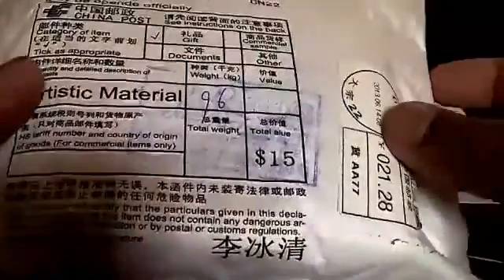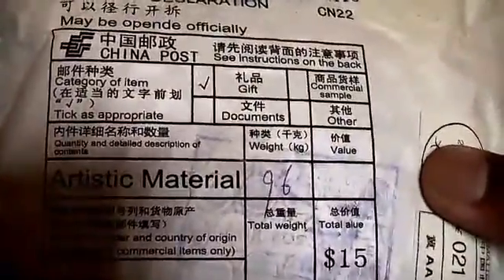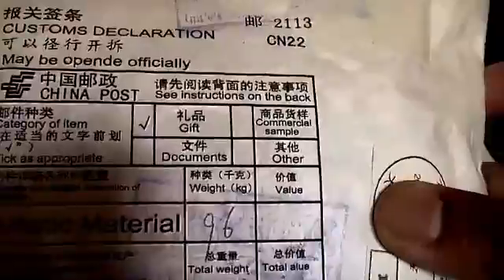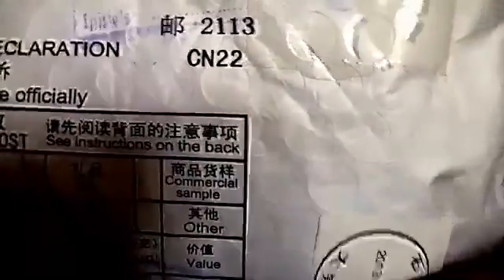Here's the package I've won, through China Post. Alright, I can't wait to open this thing.